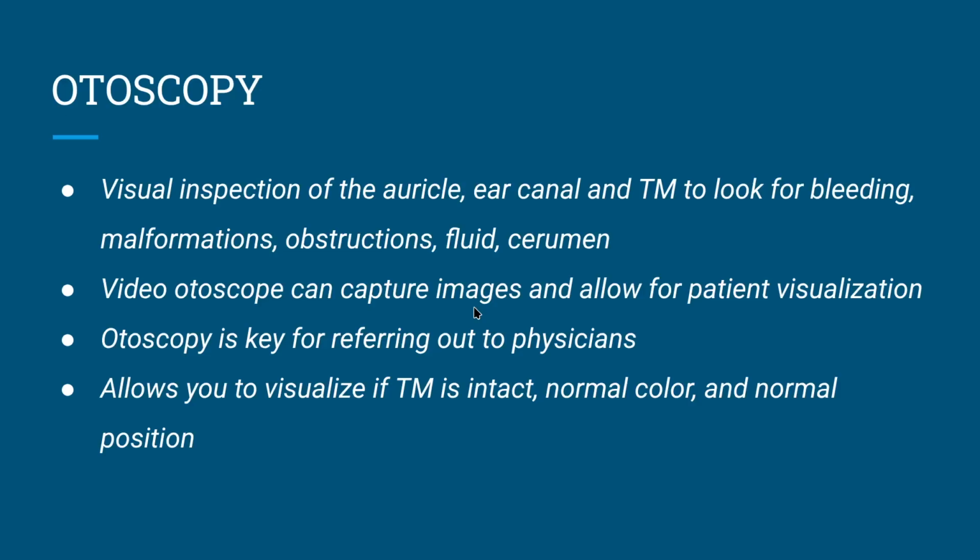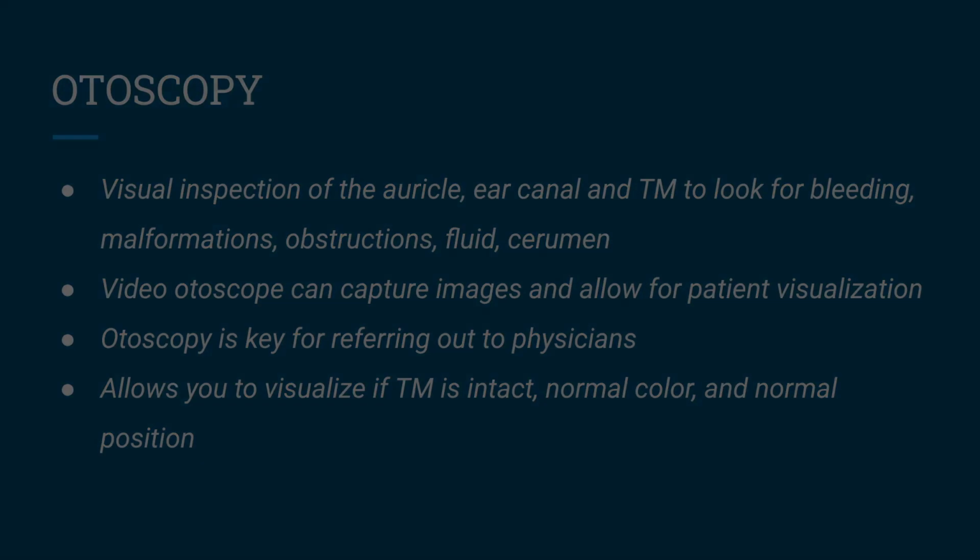Otoscopy is key for referring out to physicians. If they have an acute otitis media, if they have otitis externa, a perforation in the eardrum, those are going to be key things to look for when you refer out. If they have excessive cerumen impaction that you can't resolve yourself, you may have to refer out for that. Otoscopy is going to allow you to visualize the eardrum to make sure it's intact, of normal coloration, and in normal position.